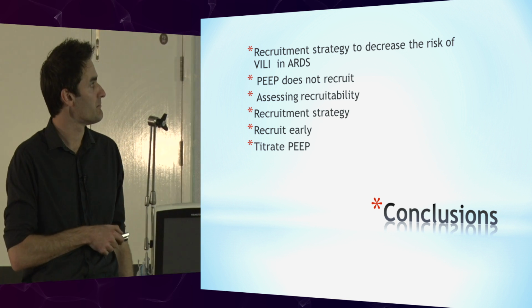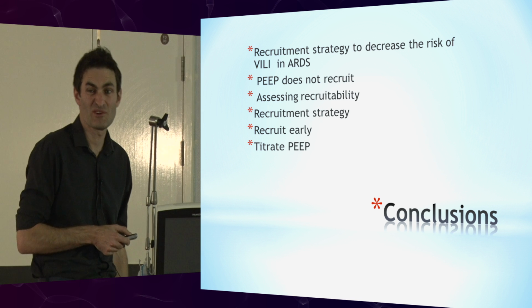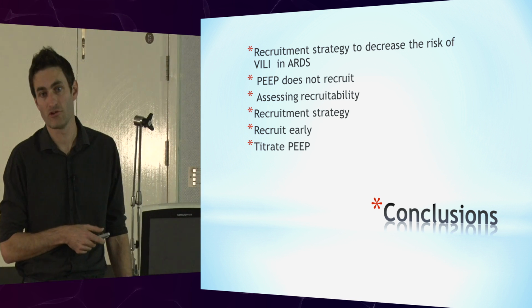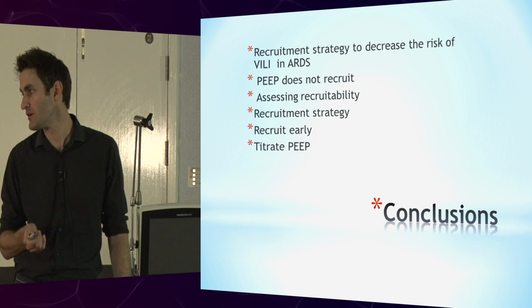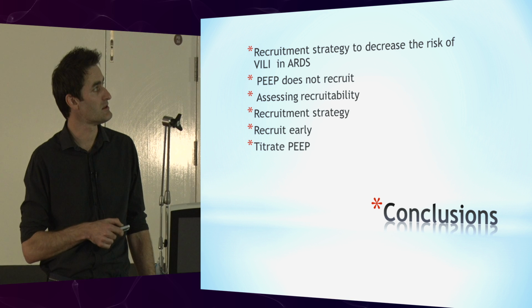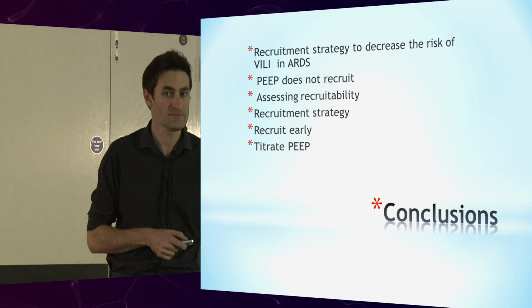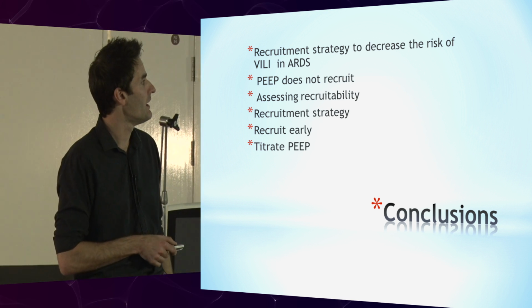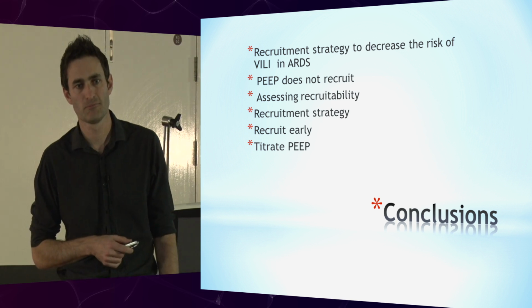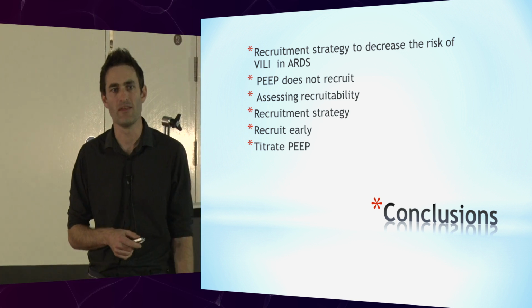We've talked a bit about how to assess whether a patient's recruitable or not. We've also talked a bit on how to do a recruitment manoeuvre, all right, and we're going to have another go at that later. I think key message really we talked about as well at the beginning is that we should be doing this early, all right, and then I've sidestepped the issue of talking about PEEP and how to set it, but we can talk about that a bit more later on.